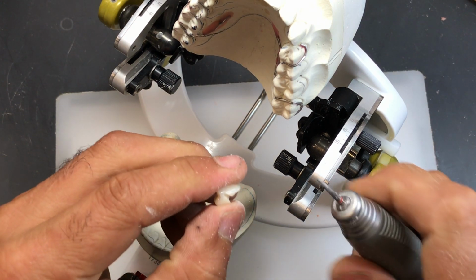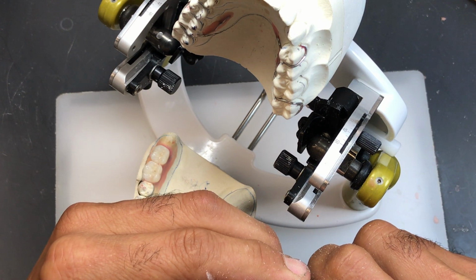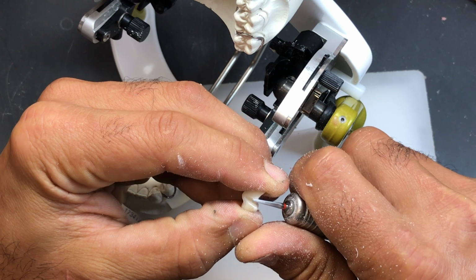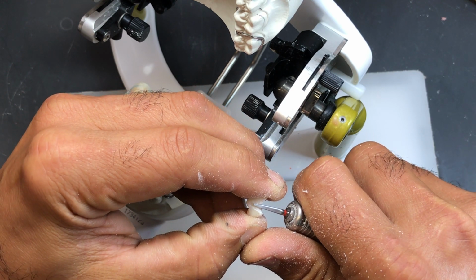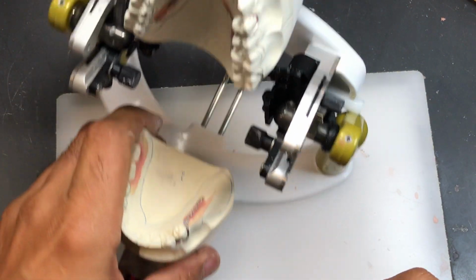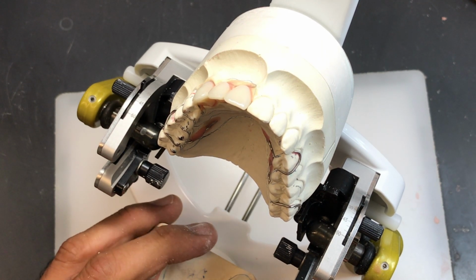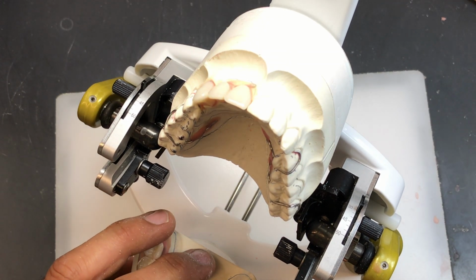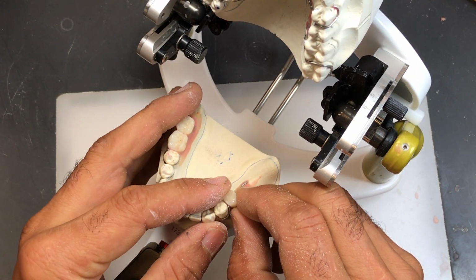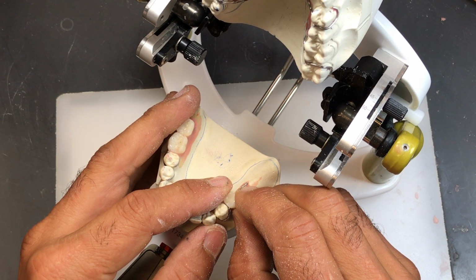Just a little bit in here, just to open it up a little bit more. Not so much at the marginal ridge, but more so below that. Let's see how this works now. And that feels like the tooth is butting right up against the natural tooth a whole lot nicer, closer anyhow.